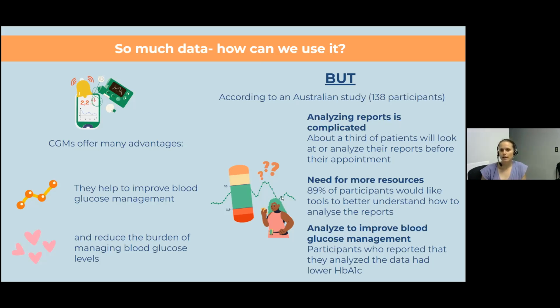If we look at an Australian study where 138 people living with type 1 diabetes were surveyed, we saw that most of them reported that analyzing these reports seemed complicated and complex. Most people said that they would like to have tools to better understand how to analyze the reports.